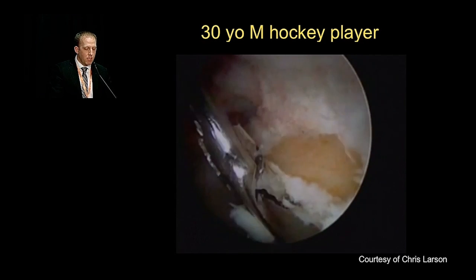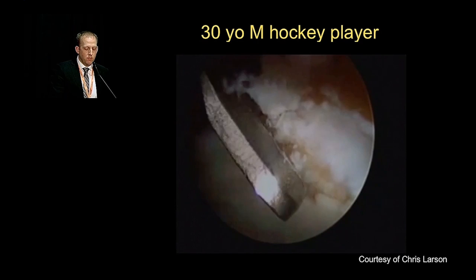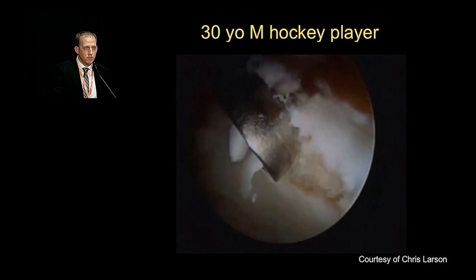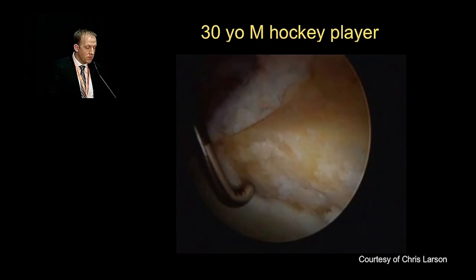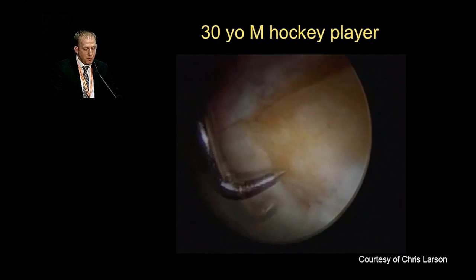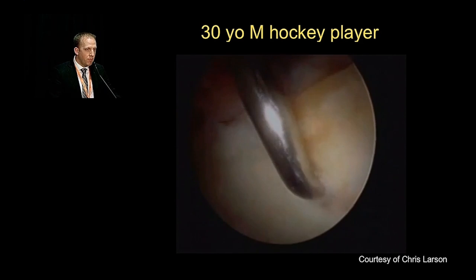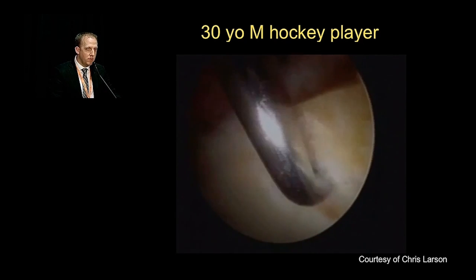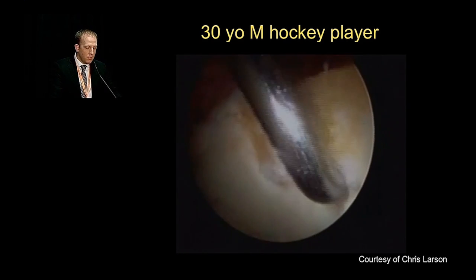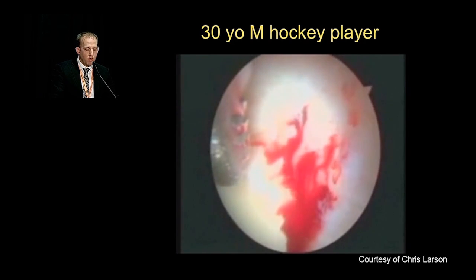Here's a 30-year-old male hockey player who underwent a microfracture. We're removing the loose chondral stable flap with a biter, followed by ring curettes — not only to create stable margins of the adjacent cartilage but also to remove the calcified layer. It's important to have a stable margin as this is best for outcomes. With the microfracture awl, you don't necessarily have to mallet it into place; simply wiggling it into the bone can be quite efficient. At the end, verify by shutting off your fluid and observing that the marrow elements are egressing.